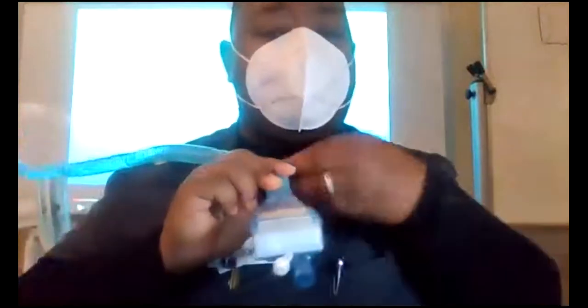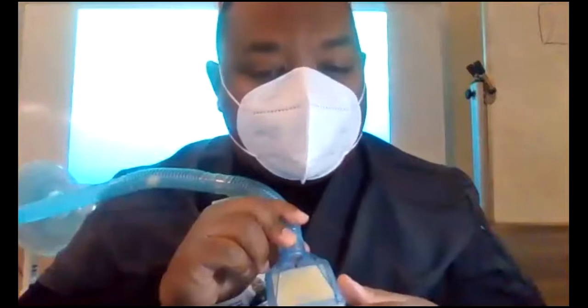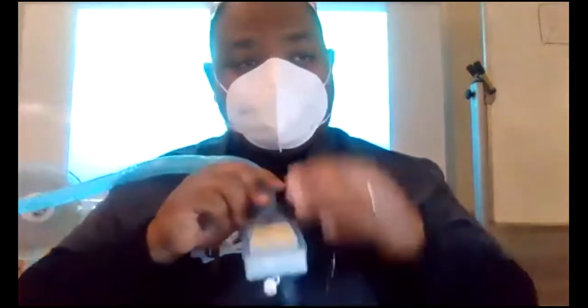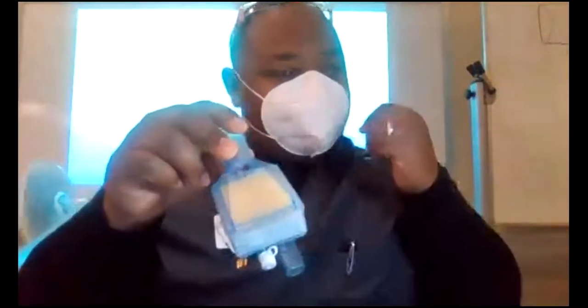Heat moisture exchanger. What I do is I blow into the device, and then when I inhale, it gives me my heat and my moisture right back. So I blow heat and moisture into here, and when I inhale, it gives it right back to me. It's an exchanger, okay?